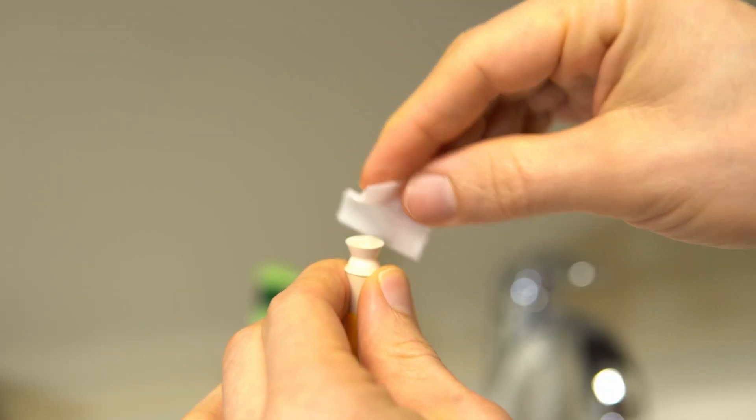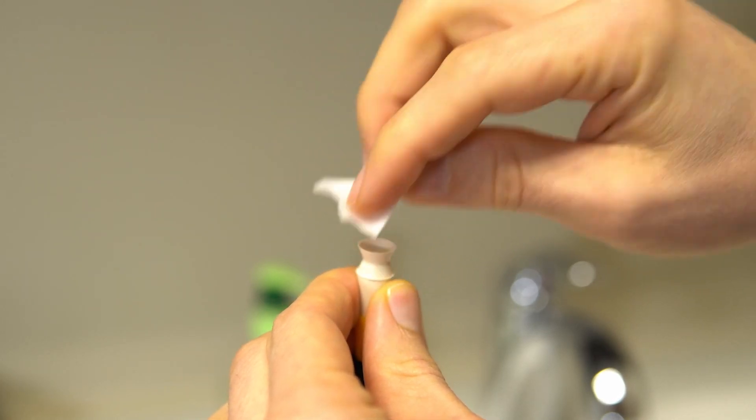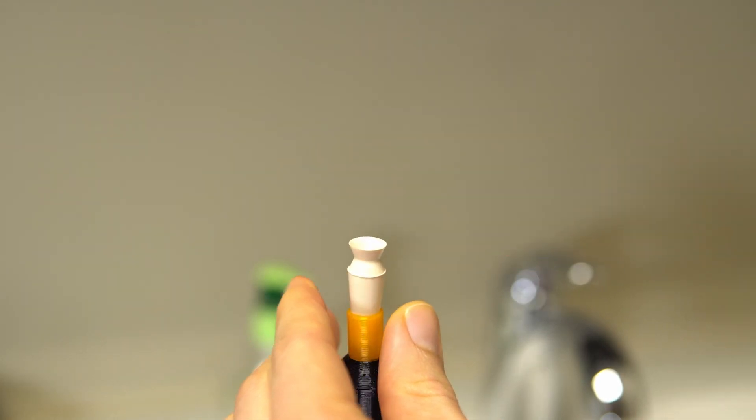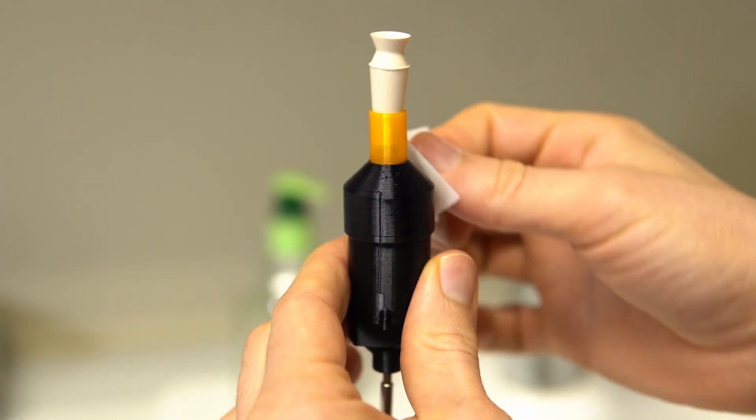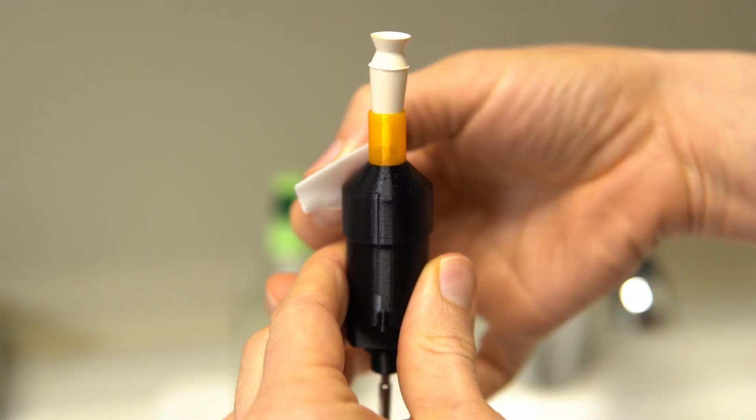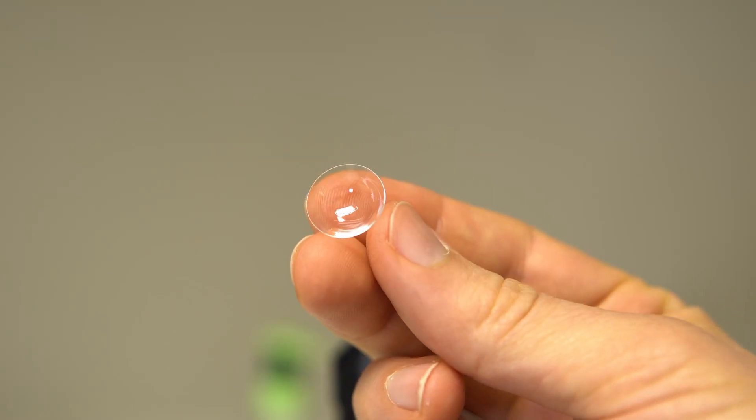Step six: clean the rubber lens holder with a disinfecting alcohol wipe. It's important to allow the lens holder to dry completely before placing your contact lens onto the holder. Step seven: clean the upper arm segment of the light unit, the part that twists, with a disinfecting alcohol wipe.